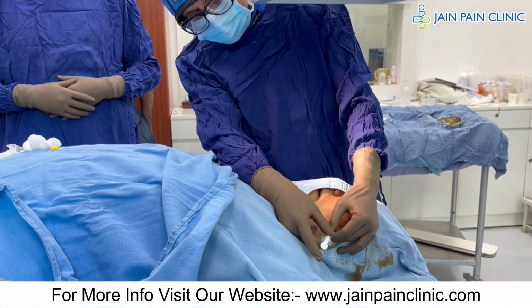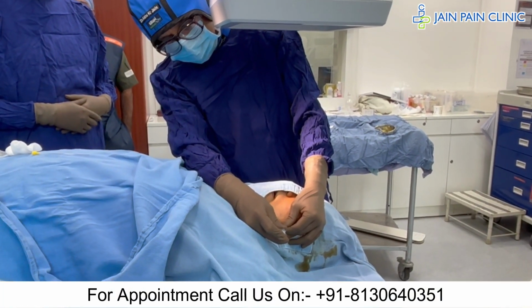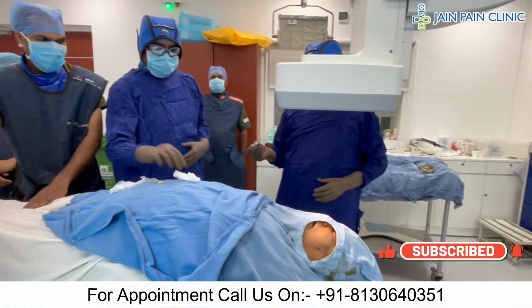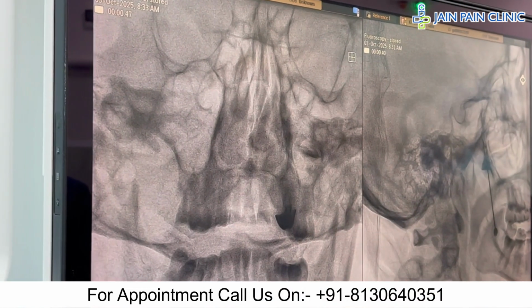Now we will inject the medicine. This is local anesthetic with dexamethasone, ropivacaine with dexamethasone. I have injected 2 ml and the needle is out. Okay. So this is all.